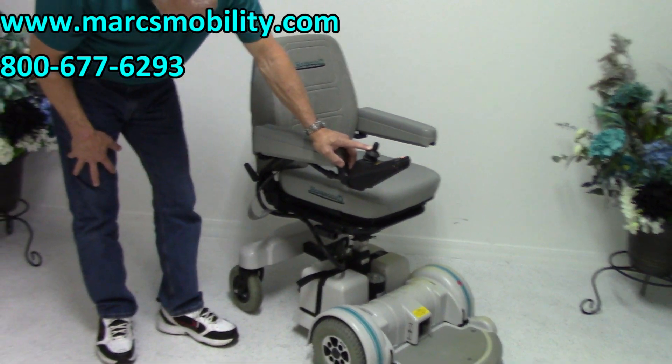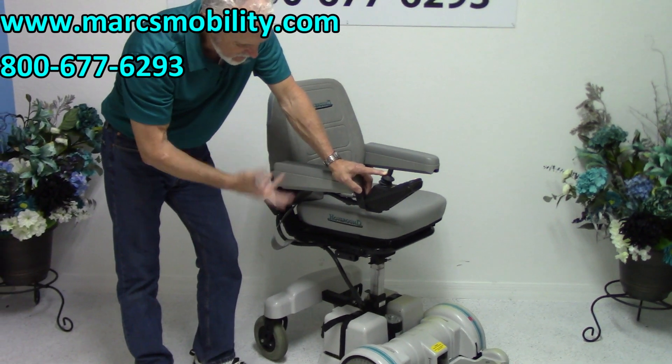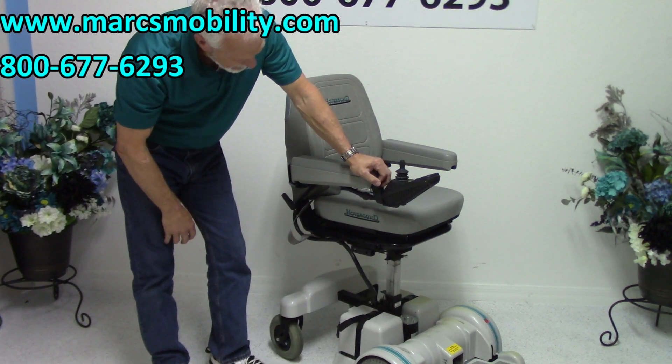This is your seat lift, and this noise is perfectly normal. We're in a small room here, but that's the noise — it's perfectly normal. This is the seat lift.